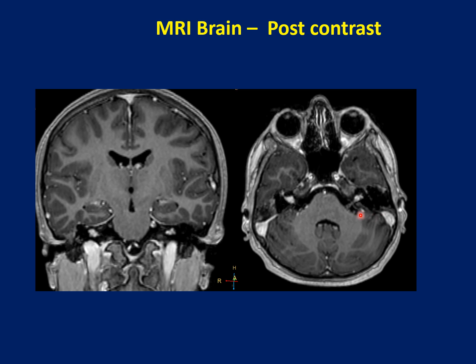We picked up this particular enhancement in the post-contrast image, which led us to do a BFFE sequence which was shown earlier. So there is an enhancement which is seen within the temporal bone. So this is along the course of the 7th 8th nerve complex, extending into the cochlea as well as in the semicircular canals. The coronal images, again we are able to see the enhancement which is seen within the bilateral internal auditory meatus extending into the vestibule as well as the cochlea.